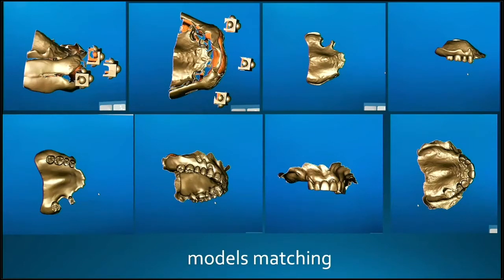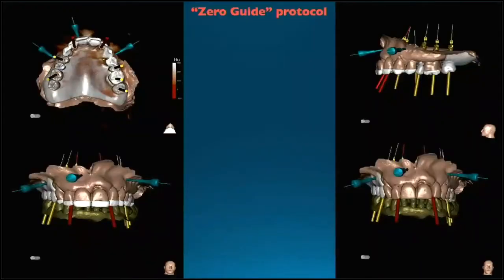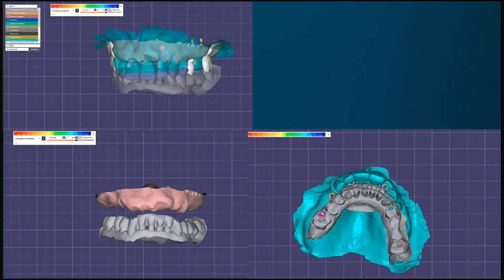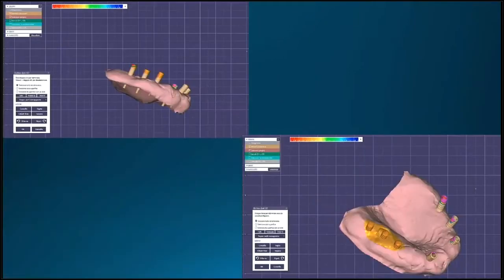The aim for me is to maintain the height, the vertical dimension, the balance, the contact points. I want to maintain, and the digital is absolutely the right way to maintain 100% of information. This is how we work today.